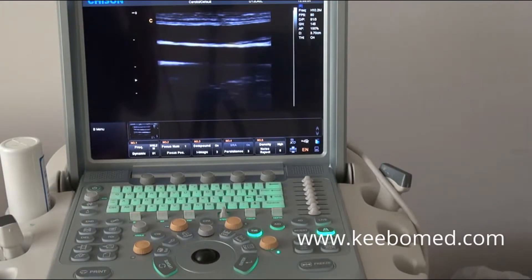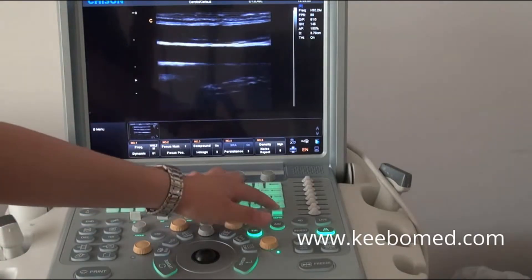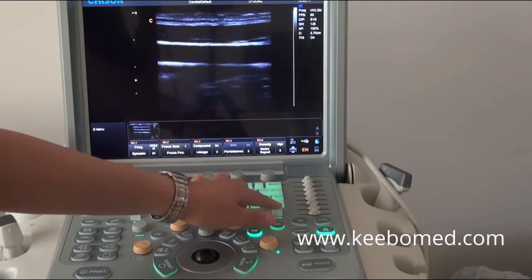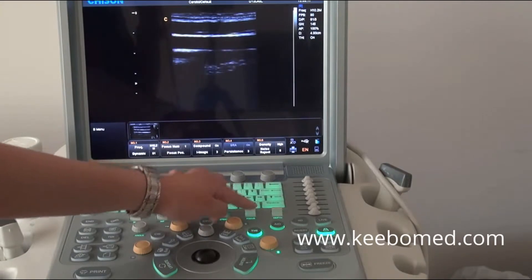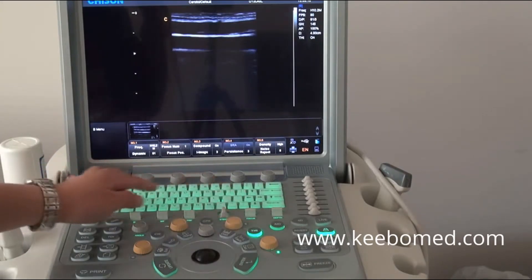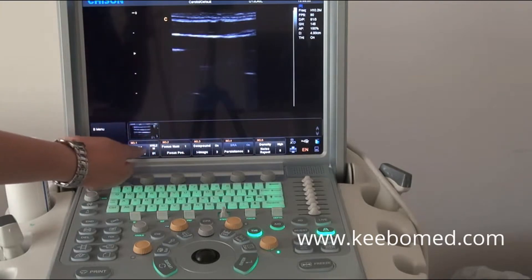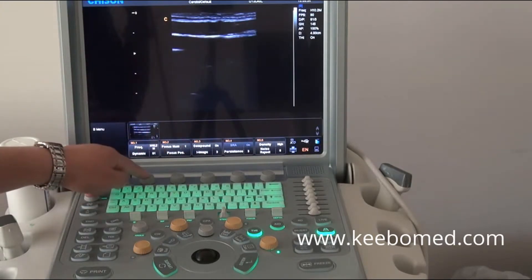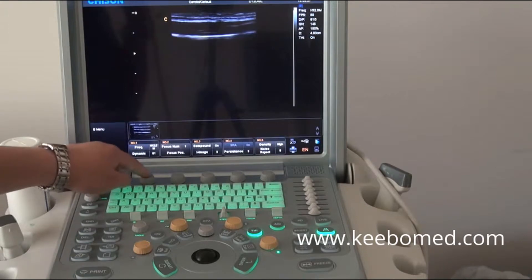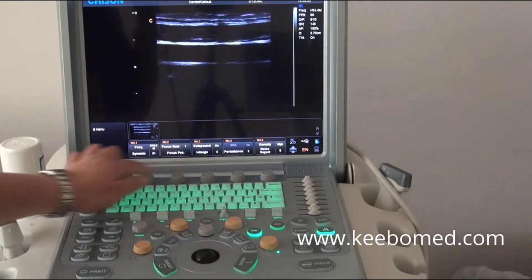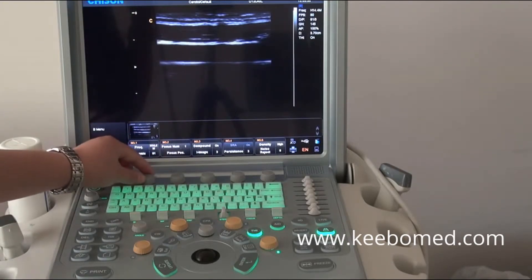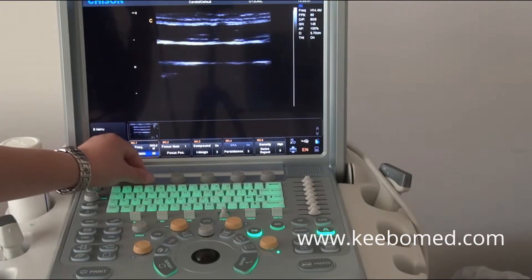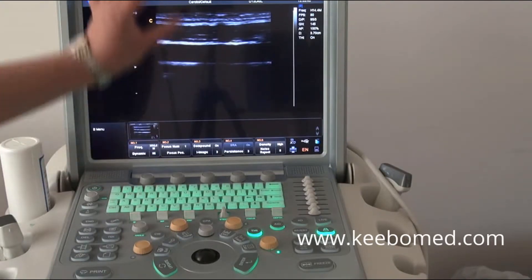In B mode, the parameters that doctors often adjust include depth — to increase and decrease — and next is the focus position. We also have two line parameters. The first line: we can press the knob to adjust it, like the frequency. The second line: we can rotate the knob to adjust the dynamic range to enhance the image's contrast.